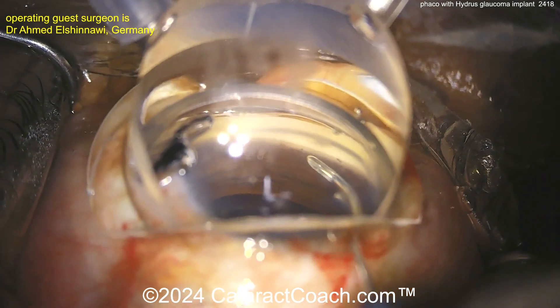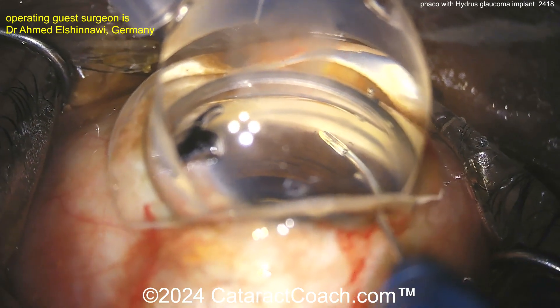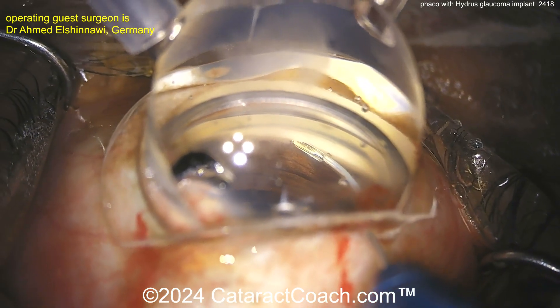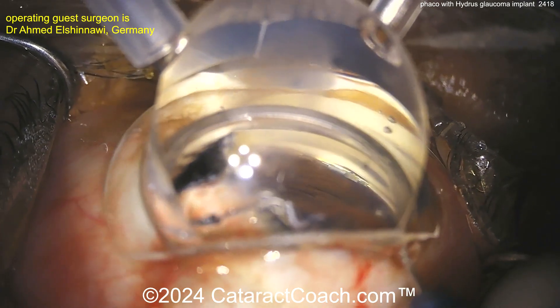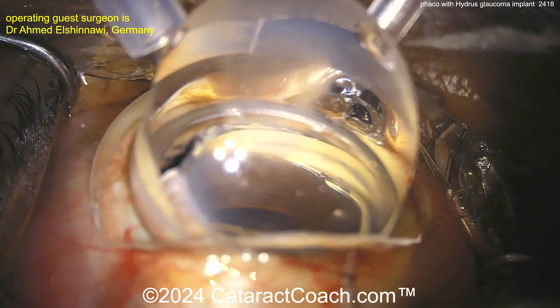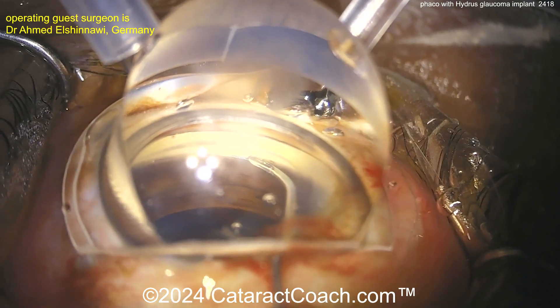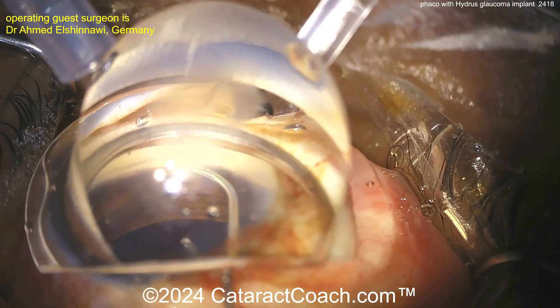Getting the device angled and slowly advancing it into good position. Here comes the device — it should float in very easily and glide in without any resistance. If you feel a lot of resistance, you may be in the wrong position or not at the correct tissue plane. Use the cannula to help push it in a little bit further.